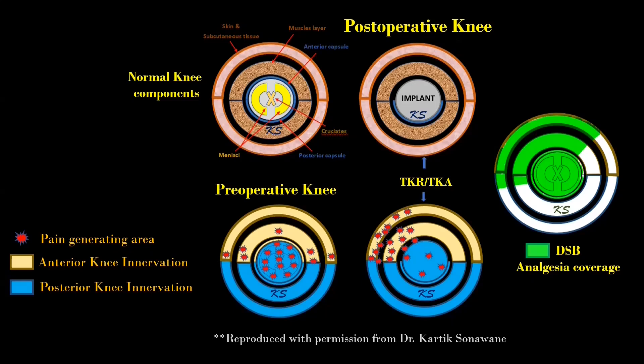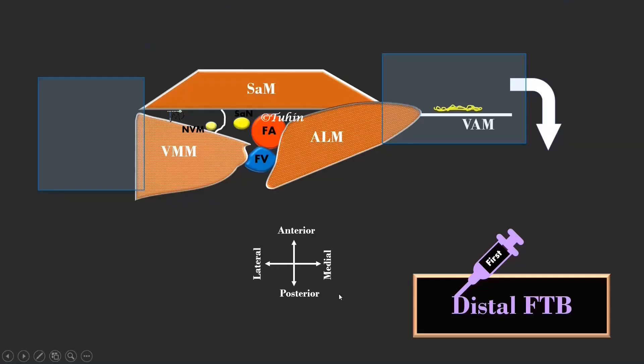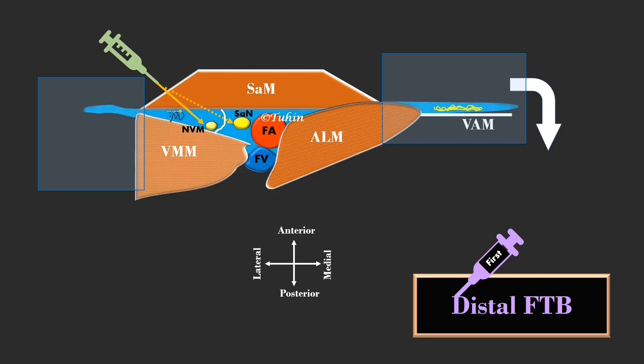The first injection is performed at the distal-most part of the femoral triangle, just one to two centimeters proximal to the apex. Here the saphenous nerve lies lateral to the femoral artery, and the nerve to vastus medialis lies further laterally in the intermuscular space between the sartorius and the vastus medialis muscle. Please remember there is no vasoadductor membrane in the femoral triangle. Sometimes the saphenous nerve and the nerve to vastus medialis are separated by fibrous septa, hence we need to perform two separate injections targeting each nerve distally.